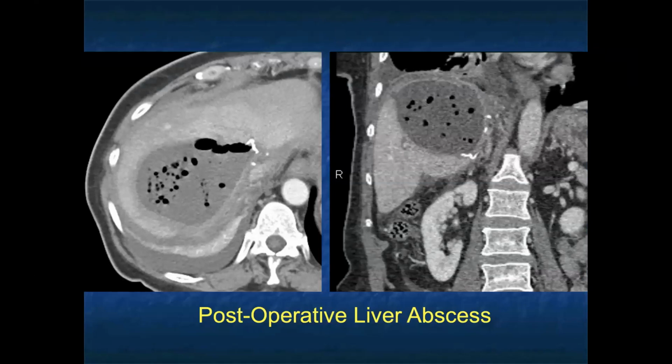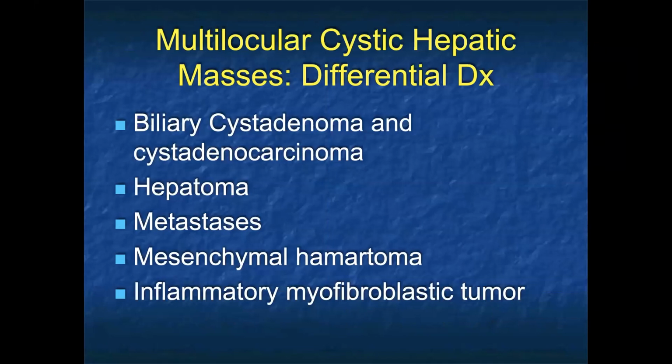Obviously, cystic lesions with air bubbles, you can occasionally get fistulas, but most commonly it's in a case like this with multiple air bubbles, air fluid level, and it's an abscess in a post-op patient, but that's not very difficult. I have seen patients who've had cysts in the liver, which secondarily get infected in patients with ascending cholangitis. So that can indeed happen.